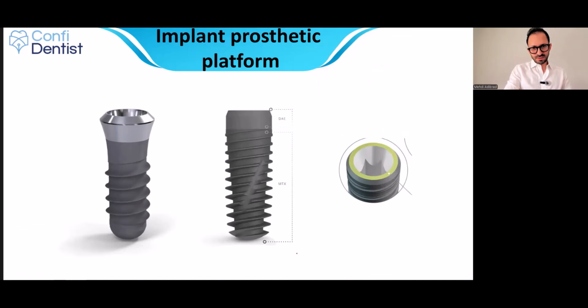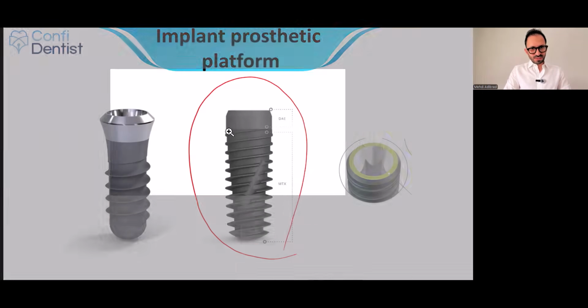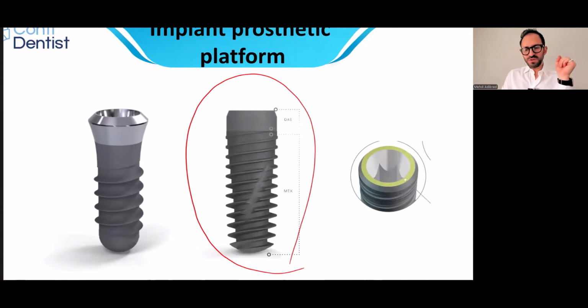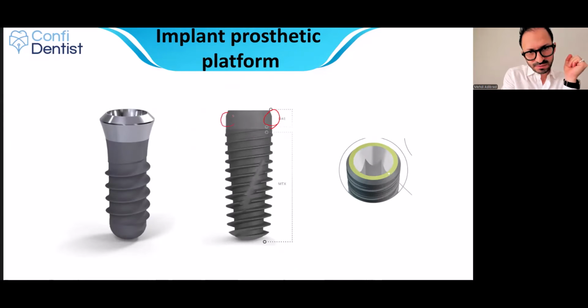So this implant is a very tricky one. If you pay close attention, you can see toward the coronal 3 millimeters, we have very, very fine micro threads. Maybe it's a little bit difficult in this picture to detect that, but this design is different than this one. That tissue level one is very, very smooth.